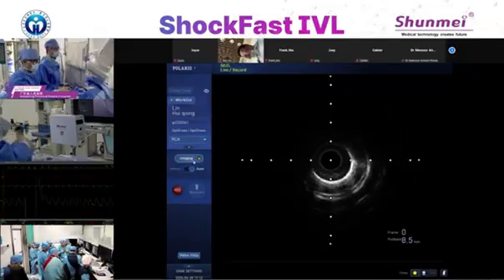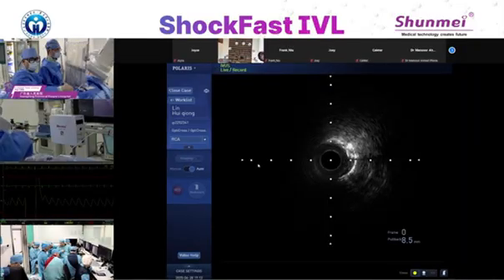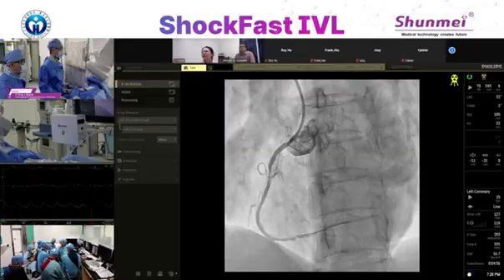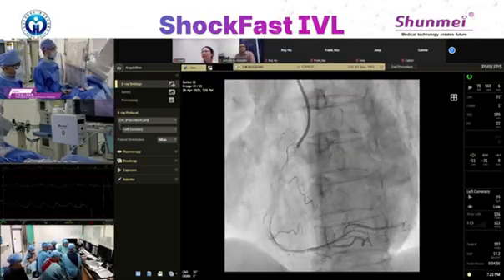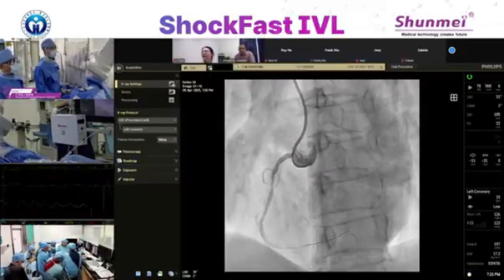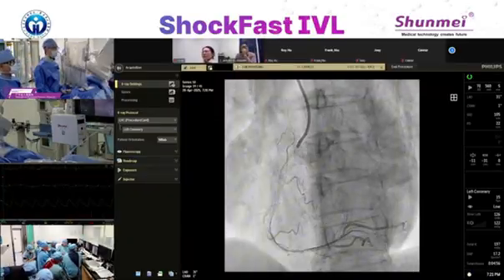It's fine to go to the PDA. Let's go to RPL. All the vessels are open.